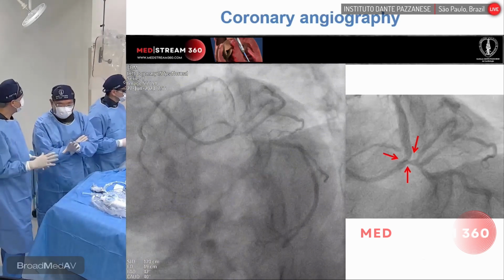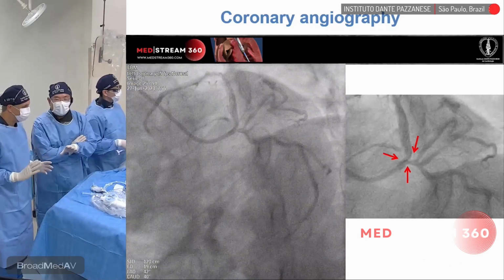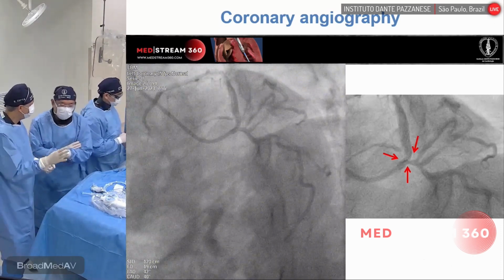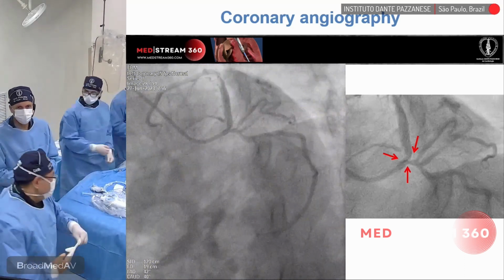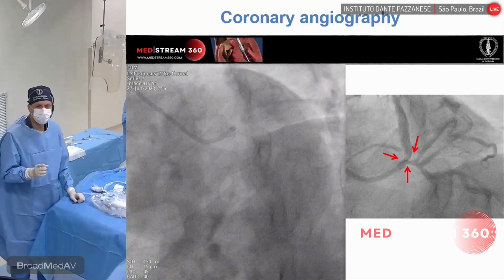I know last week we demonstrated here the angio-based physiology, the MFR, a very, very interesting system that you can do by angio. Very easy to do. Could you demonstrate that? Can we do it online now? Yes, I'm going to do this. So maybe again you can assess the LAD plus the left main and the circumflex. Yes, see what it shows. Perfect.